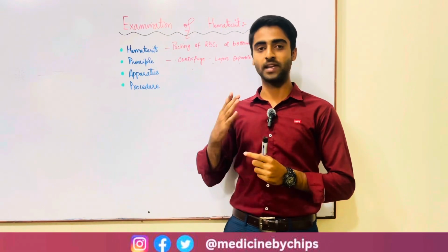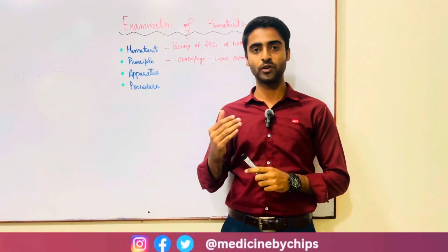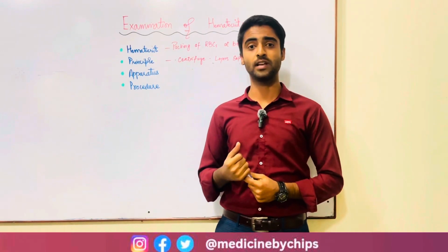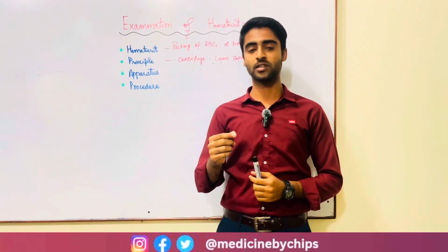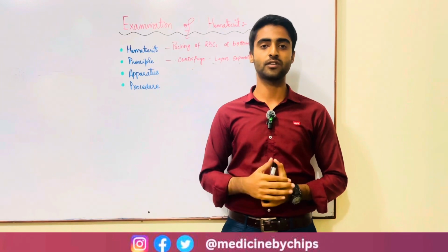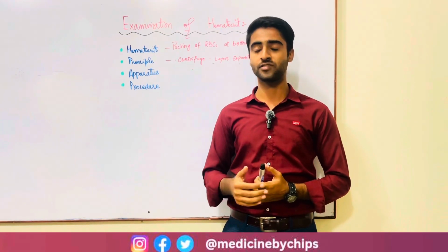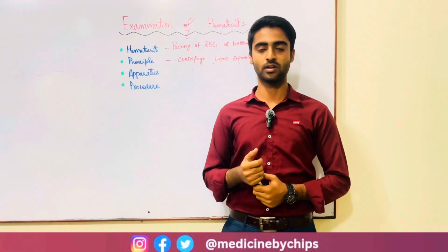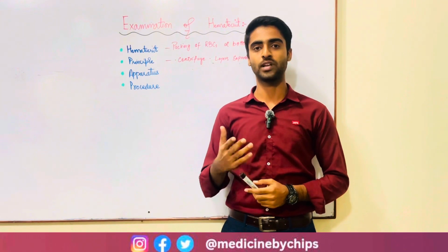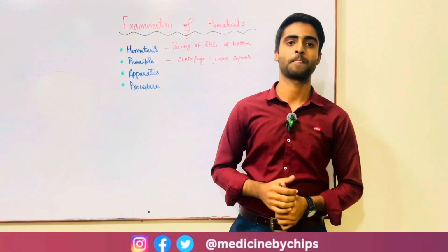Then you place the capillary tube on the blood and the blood will move into the capillary tube through capillary action. Then you seal the end of the capillary tube so that the blood will not come out, place it into the centrifuge machine and centrifuge it for 3 to 4 minutes. There is a microhematocrit reader which gives the reading of the experiment, and you note it down in your notebook. This is all about the examination of the hematocrit value.